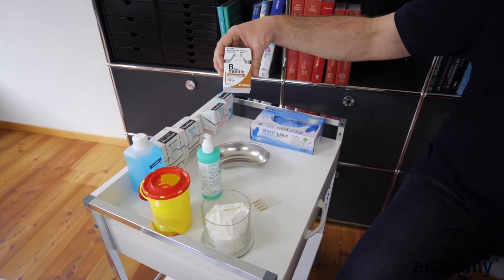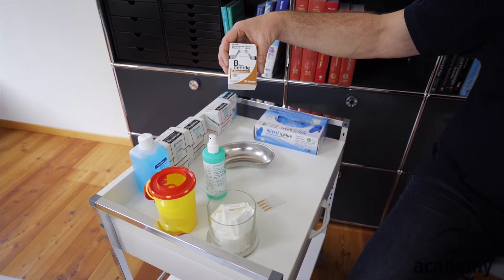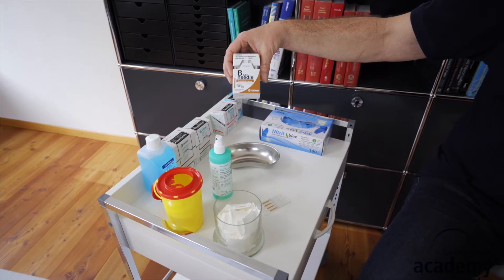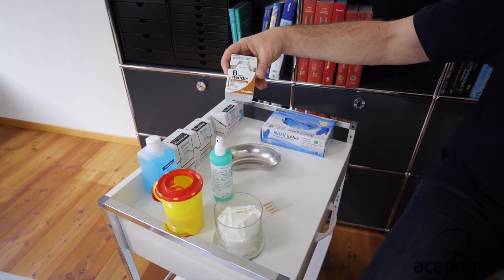Regarding the needles, we use Siren needles since 25 years. We've used 10,000 needles and never had any problems with them. I'm sure that there are other good needles on the market, but we just don't have the experience with those.